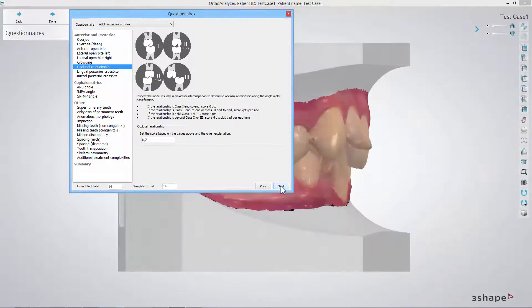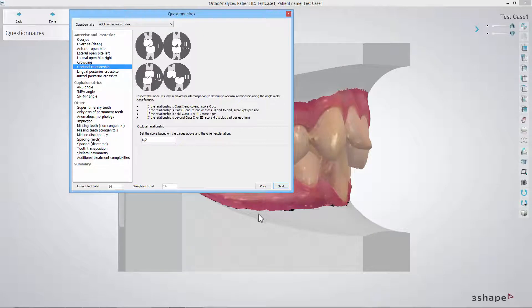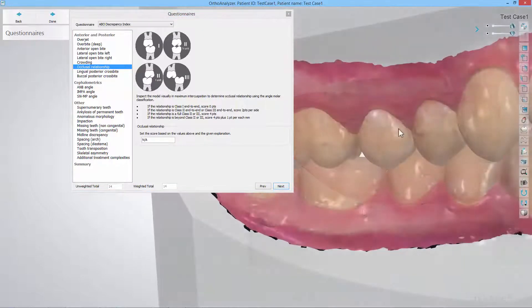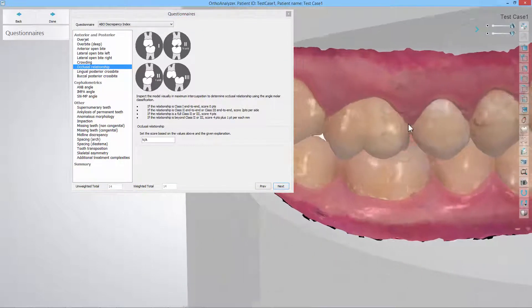In the occlusal relationship step you should inspect the model regarding the occlusion class and fill in the result accordingly.